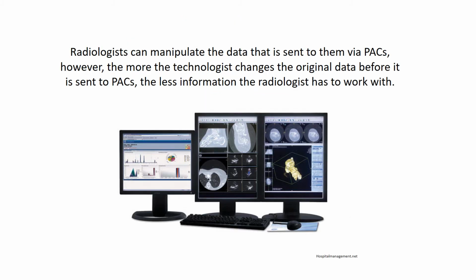Now, I mentioned that the technologist will often make changes before they send that image over in PACS. Some departments don't like the technologists to do that very much. There's a reason for that. A radiologist can manipulate the data that is sent to them via PACS. However, the more the technologist changes the original data before it's sent to PACS, the less information the radiologist has to work with.